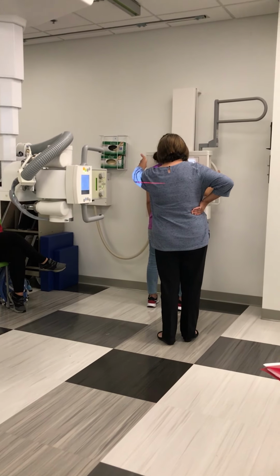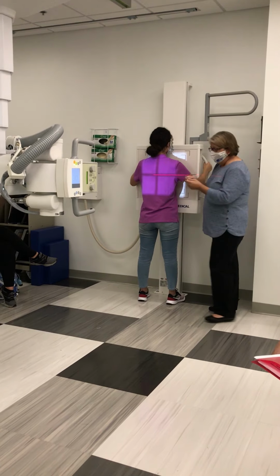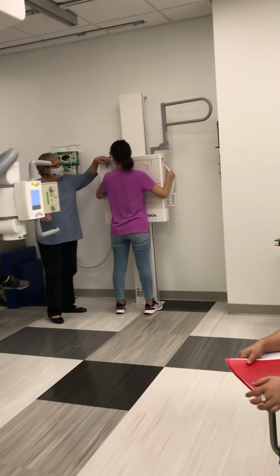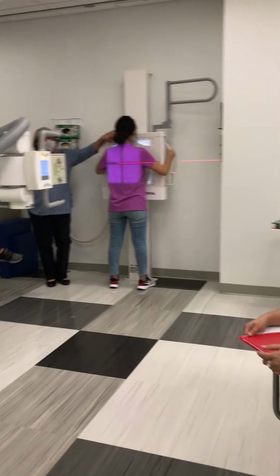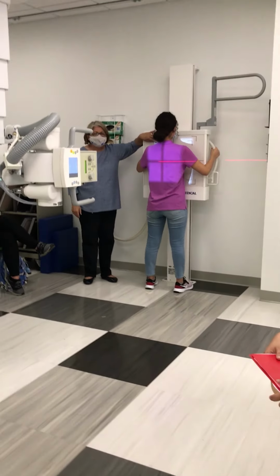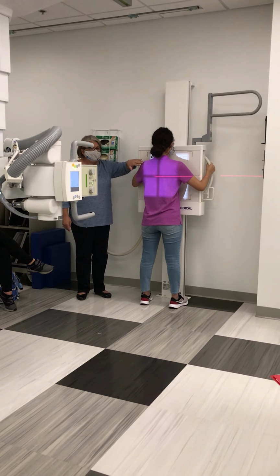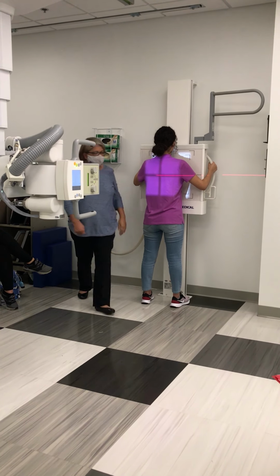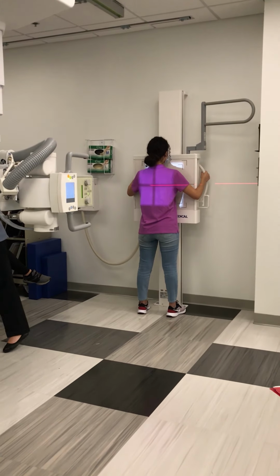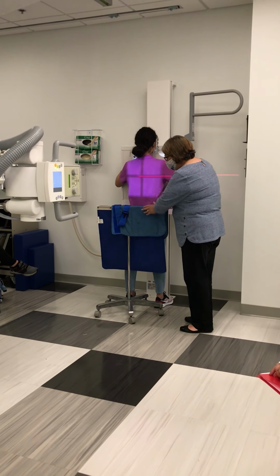Now, grab that handle that's in front of you on your left as well. I'm going to use my left marker. I'm placing my marker in the light superiorly on this side. That is going to mark my patient's left side. I'm going to roll this shielding over here. Make sure my patient's shielded.